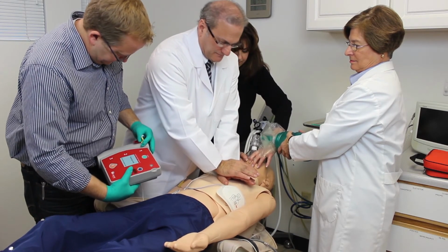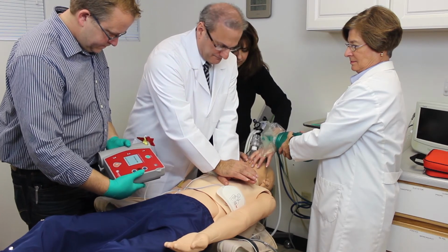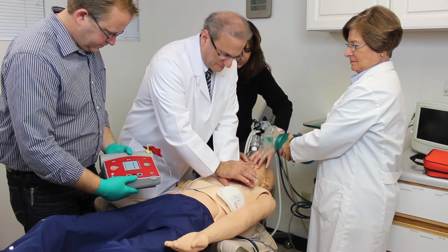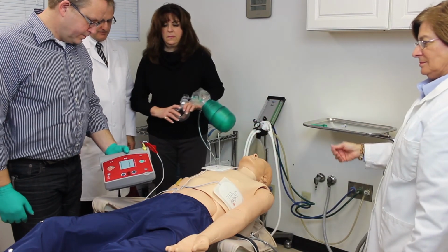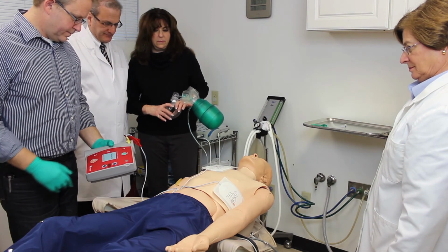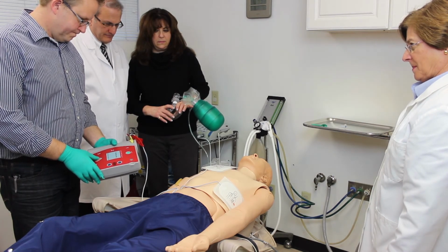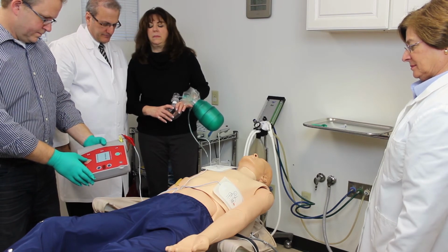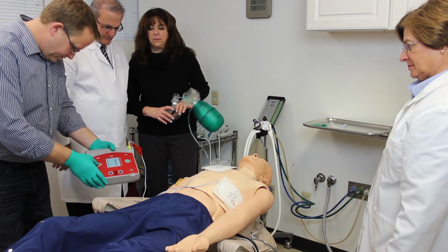Keep mobile phones away from the AED since they may interrupt the analysis. If the patient has an ICD or a defibrillator type device, place the pads 1 inch below the device. If the person has a hairy chest, take an extra pair of pads and place them on the victim, press down and pull it off, or you can simply shave the area. If the person is wearing an underwire bra, please cut it off. The EMTs are arriving. We will give them a full report and have the records available for them.